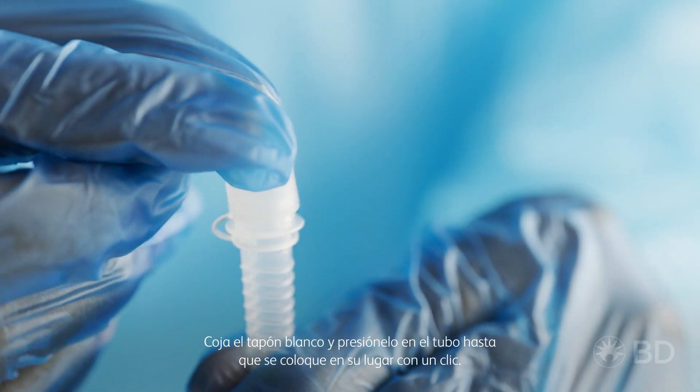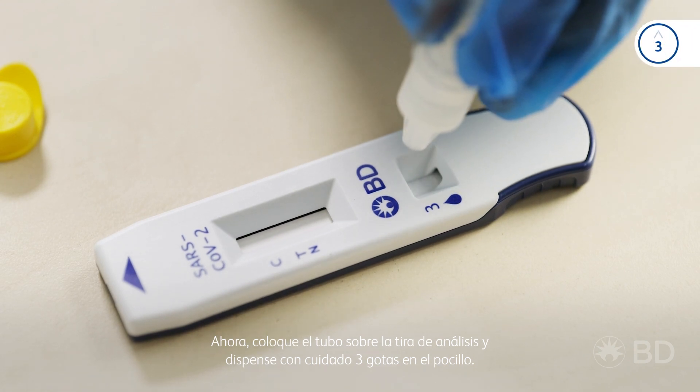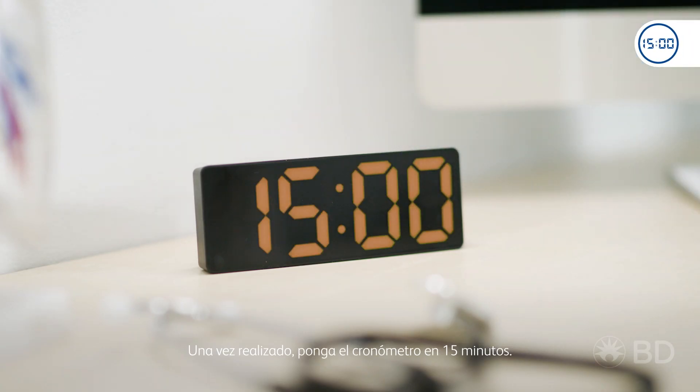Take the white cap and push it on until it clicks into place. Now, hover the tube over the test strip and carefully squeeze three drops into the well. Once that's done, set a timer for 15 minutes.